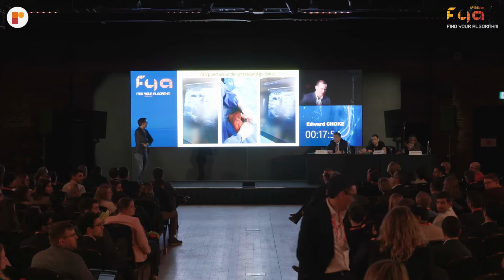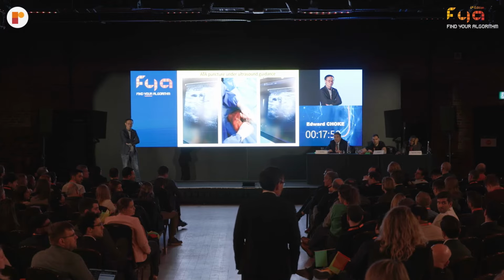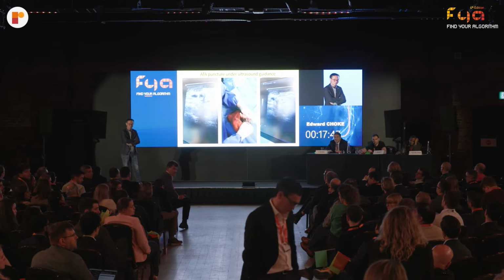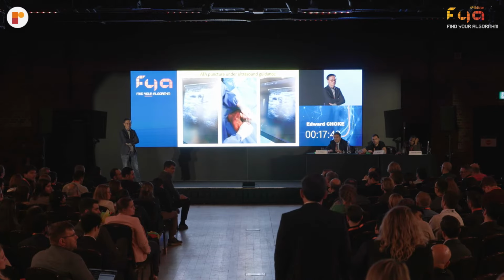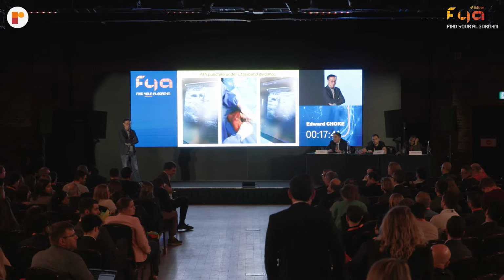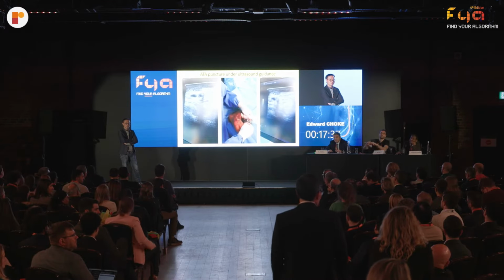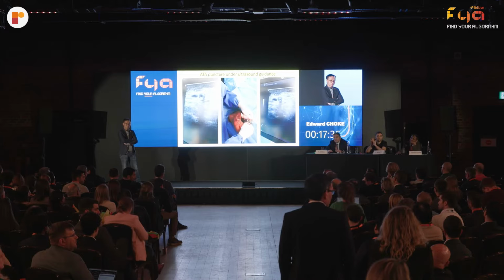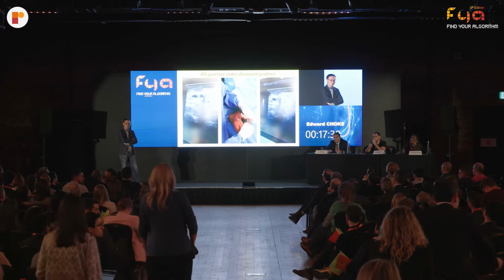Yes, with longitudinal, sometimes it seems you are inside and you are on the side, you are on the wall, and with the transverse you are quite sure to be just in the middle of the vessel. Of course, you have to move the probe millimeter by millimeter to be sure, but I find that's quite easier.